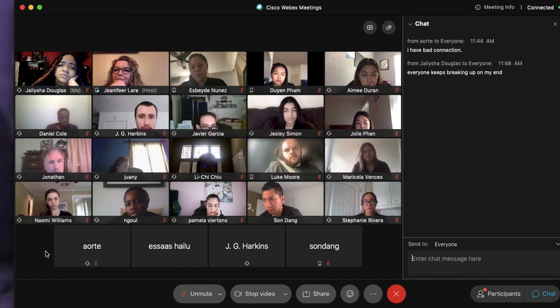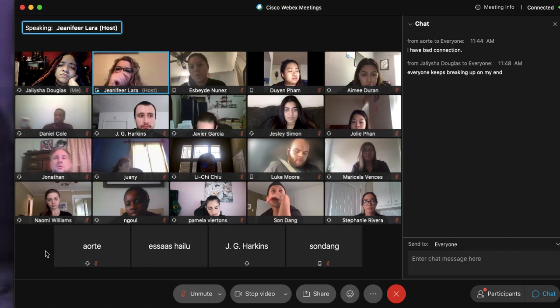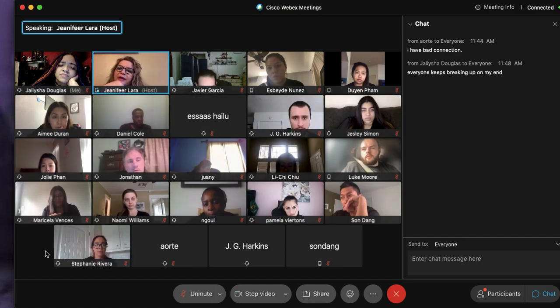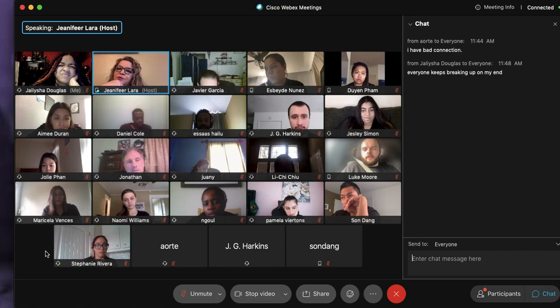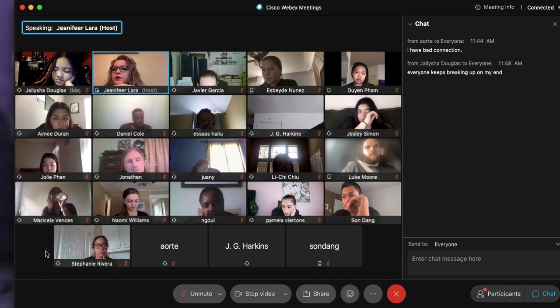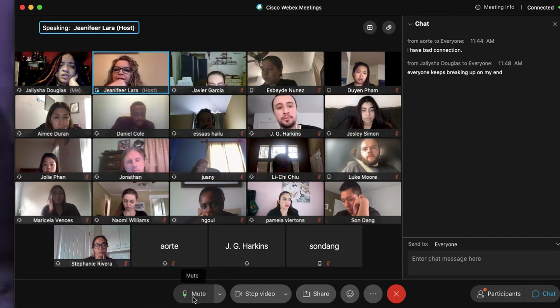Going to electronically bring the image over to the workstation. And what piece of equipment do we have to have in order to transfer the latent image stored on the imaging plate to the monitor, Javier? Don't leave me hanging. What is that called? Do you know what that is called that you feed the image receptor into? Well, the Bucky is what holds it. Now, we're going to talk about the magical Bucky later. But what is that equipment called? Isn't it called a reader?